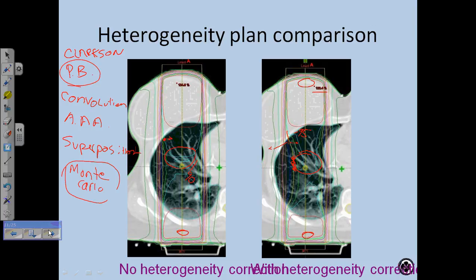As we did that, I went to talks, and people were saying that pencil beam is terrible with heterogeneity corrections. They showed examples of pencil beam versus Monte Carlo or superposition, a huge difference. So I went back to the clinic right away, this was a while back when we started using it, and compared it to our Eclipse and AAA, and I saw the differences too. In terms of the treatment planning for stereotactic body, we were doing a big arc here and a big arc underneath.